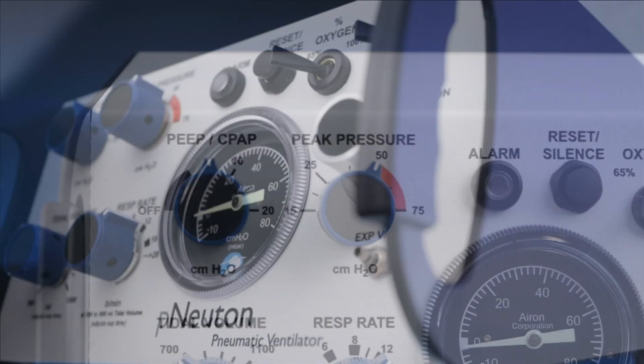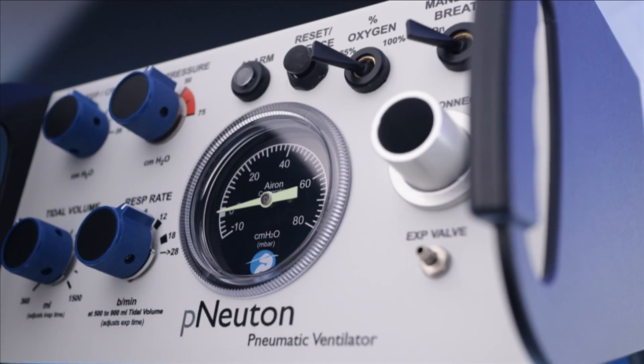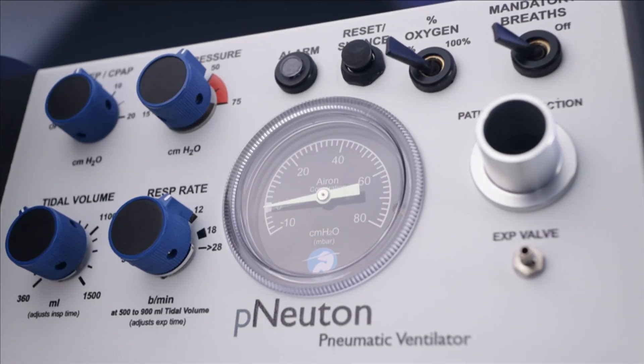What's more, the pNeuton Model A is MRI compatible. This makes it the perfect transport and MRI use ventilator, which saves transfer time, protects the clinician, and avoids complications for the patient.